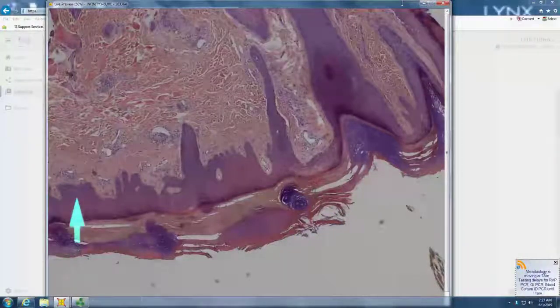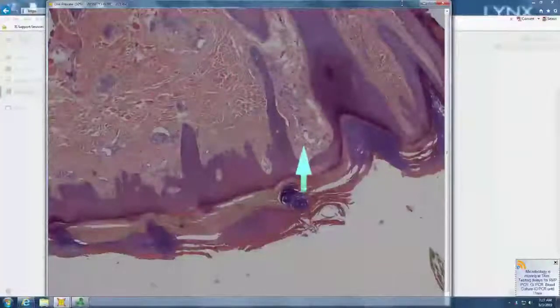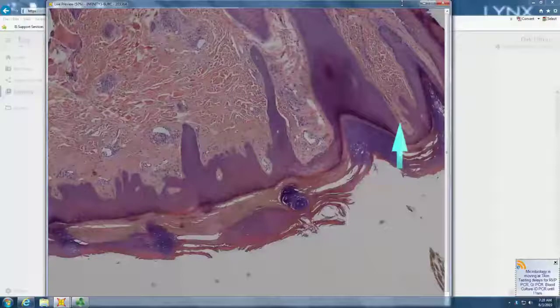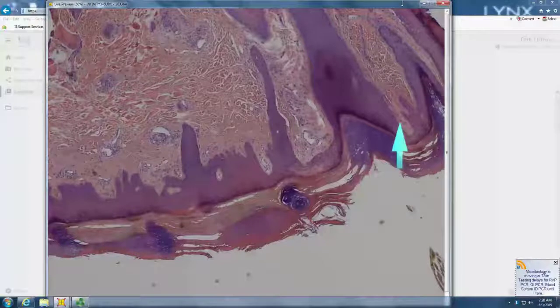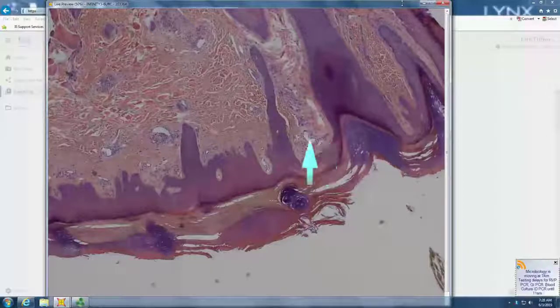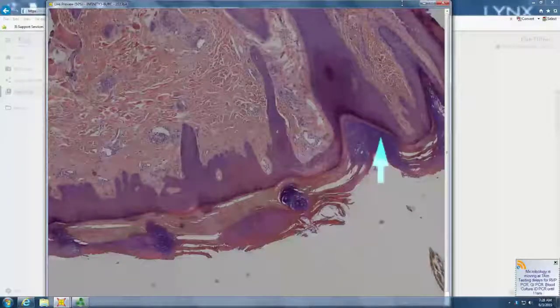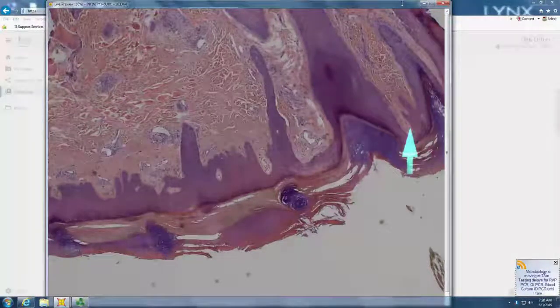You also said there's acanthosis, there's hyperkeratosis, there's angiofibroplasia of the papillary dermis, vertical streaking of the collagen. So this is LSC, or if it's a localized bump, prurigo. Same thing. Prurigo is a bump, LSC is a plaque, but they're essentially the same pathophysiology. So papillary dermal angiofibroplasia, meaning proliferation of vessels and collagen, often with time, vertical streaking of the papillary dermal collagen.